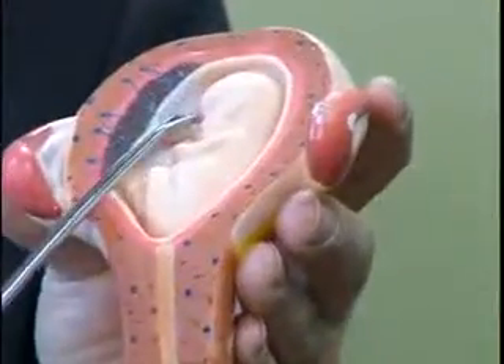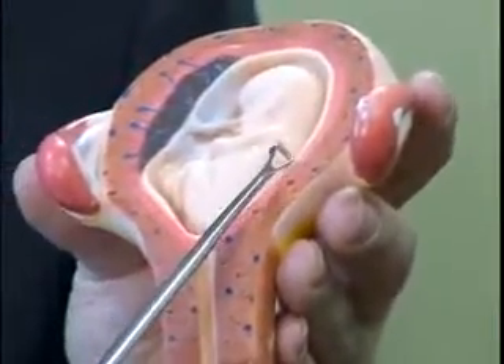Once the plastic tube has suctioned out the baby, the abortionist then takes an instrument that looks like this. It is a curette, very sharp. It is put into the uterus and scrapes out any of the remaining parts of the placenta or any pieces of the afterbirth that are still lodged in the uterus. And then finally, one more passage with the suction tube to make sure that everything has been removed.